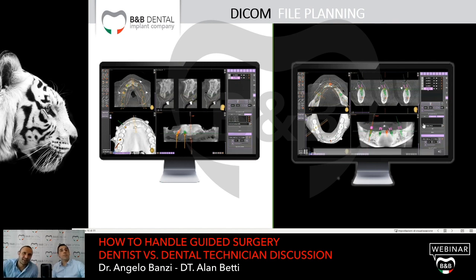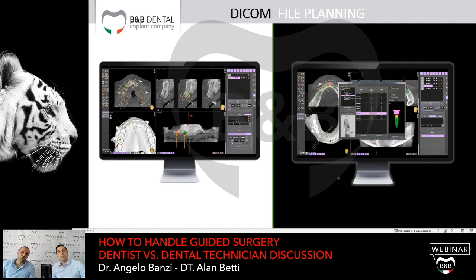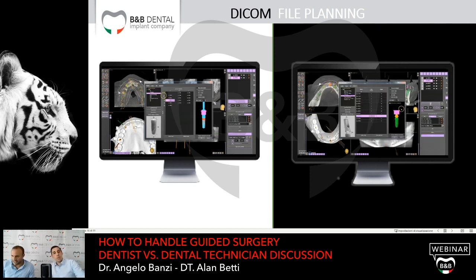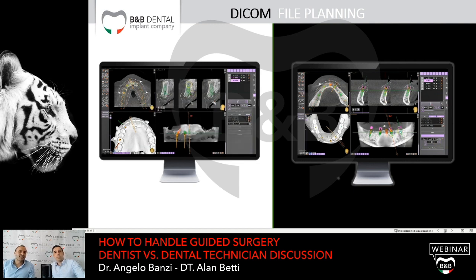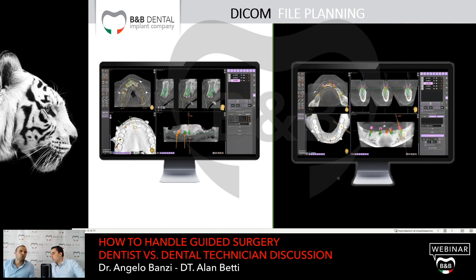This is a part that I sometimes forget, and it is an important item, because sleeves require a distance in the guided template that is a standard distance. It's always 4 millimeters. It doesn't change, okay? And the fact is sometimes when I place the implant, I want the implant 1 or 2 millimeters under the level of the bone.